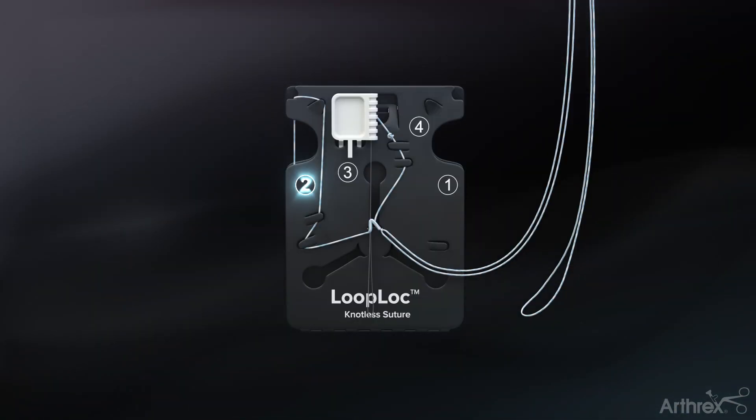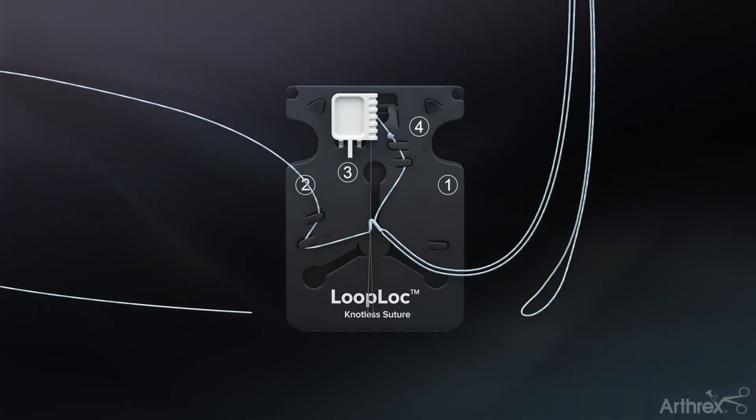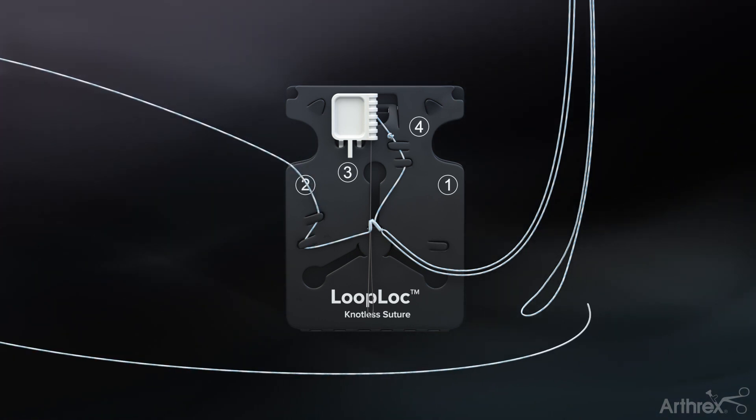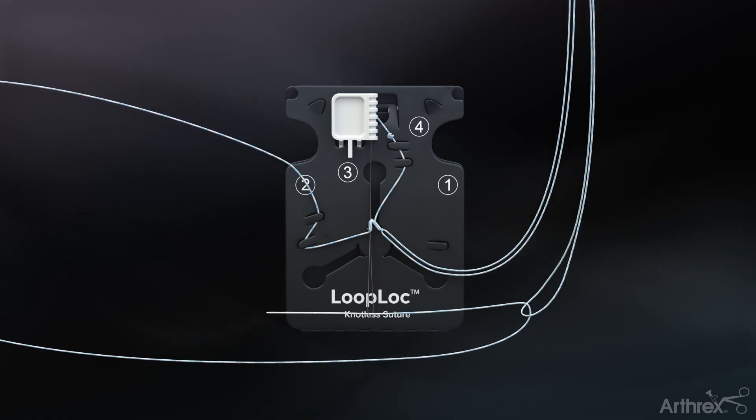Unwind the suture labeled number two on the suture management card until the tail is exposed. Feed the suture tail labeled number two through the loop of the loop-lock suture and then through the suture threader.